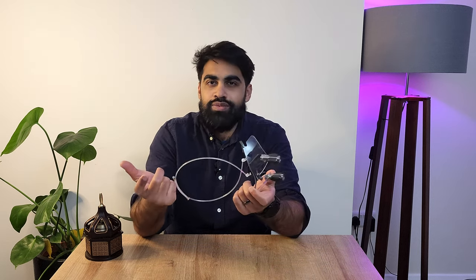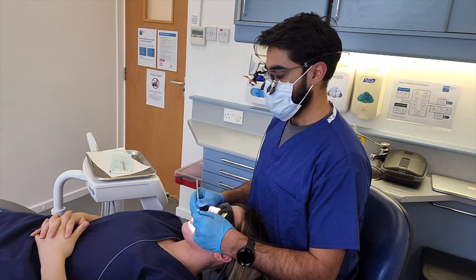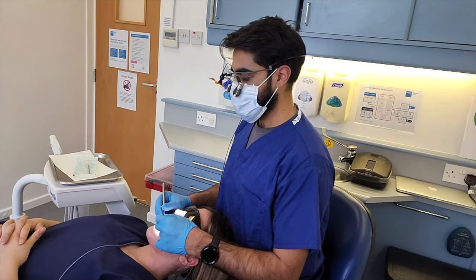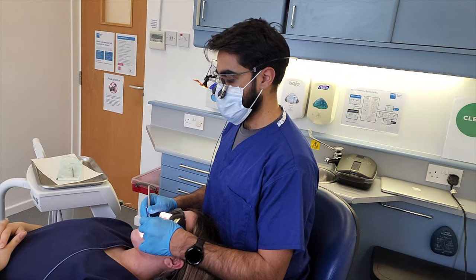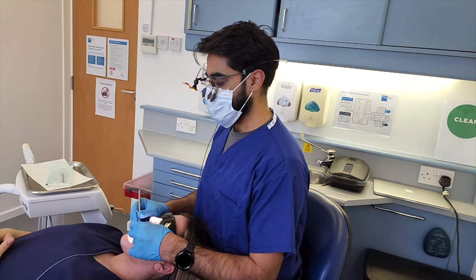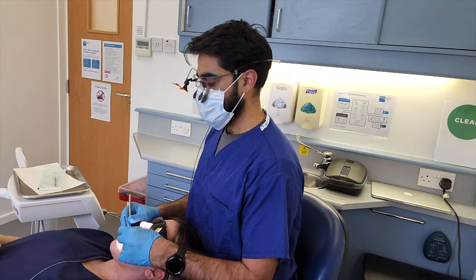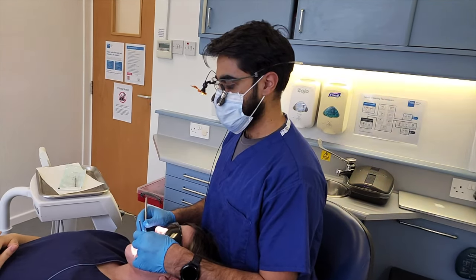I got them delivered to the practice and had a crown prep at 8:30 on a Friday morning. I came in a little early, unboxed them, tried them on, and within maybe two to three minutes I was in the full swing of things and managed to get on with the prep. I had my backup Oroscopic loupes in my bag just in case, but thankfully I didn't need them. I managed to complete the prep in good time. That said, I did have to adjust as the declination angle is quite steep.